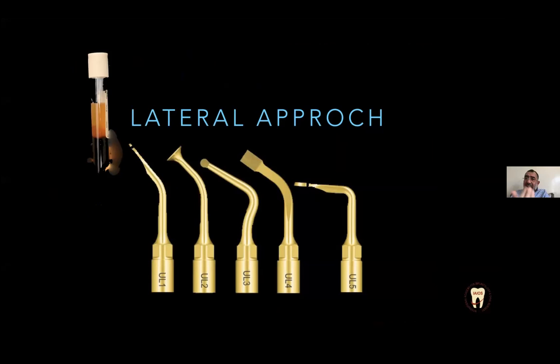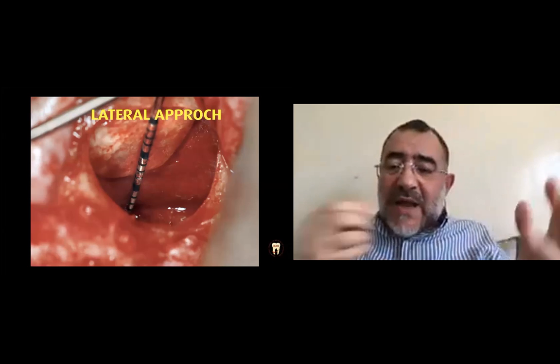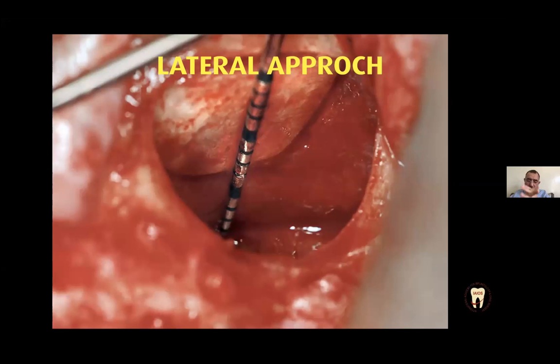You have many instruments to use when you want to do a lateral approach in your sinus lifting. In the market, you can find many instruments, many tips. In Europe, we use tips from Acteon or from Mectron. In my clinic, I especially use Mectron tips. You can find other tips in India or in Asia. It's the same. The most important thing is that you elevate the membrane with serenity, and you don't perforate your membrane. When you create the window, you can elevate it and you can fill your sinus.